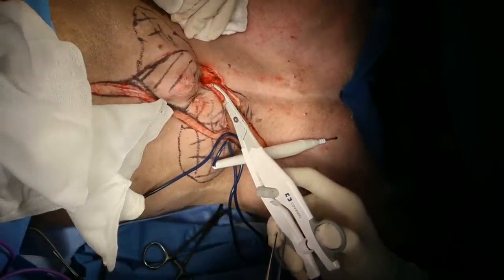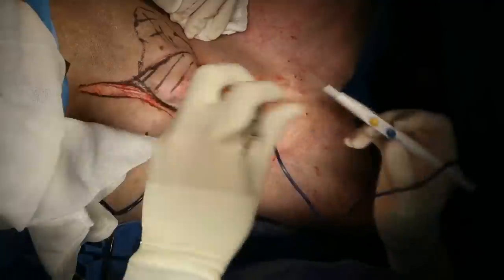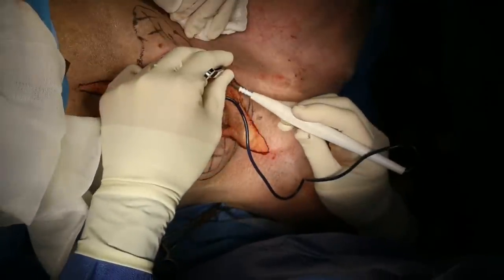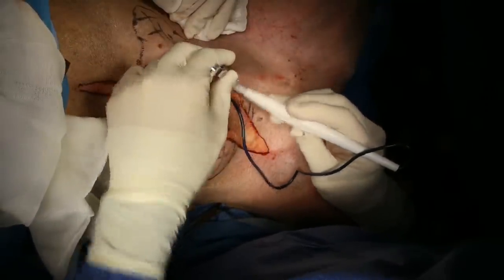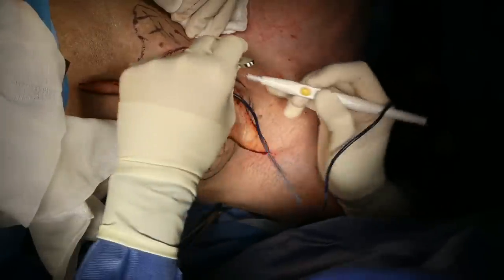It's always a good idea to try to ligate your vessels before you cut them instead of after you cut them, just to decrease our blood loss and compromise visibility.